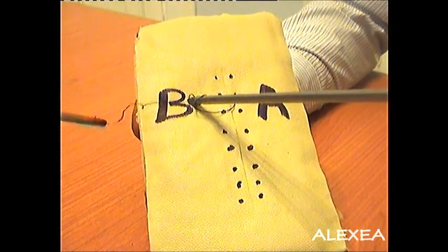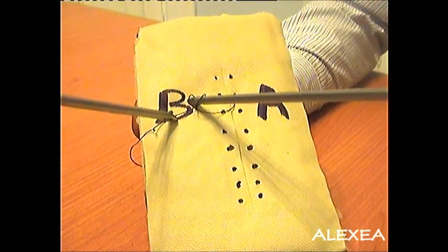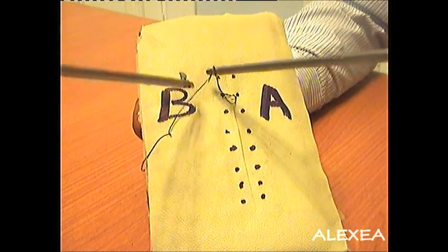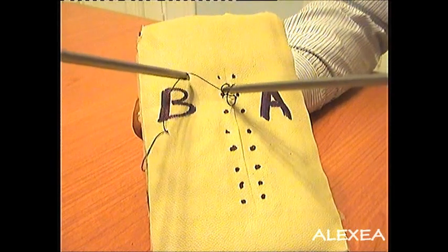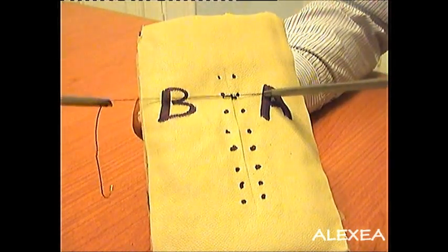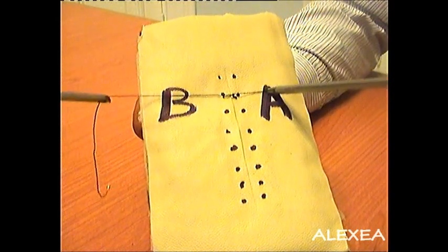Now release the thread gently, which is the longer one on side B. And side B gets pulled, side A remains short. Knot number 2 is complete.